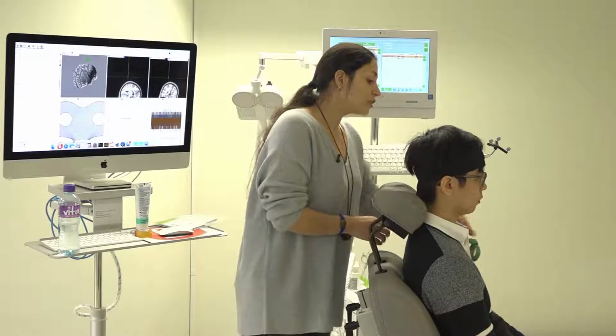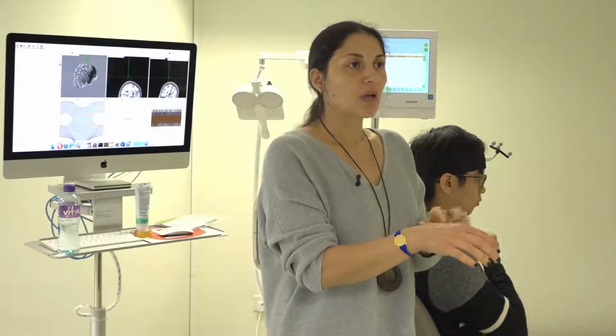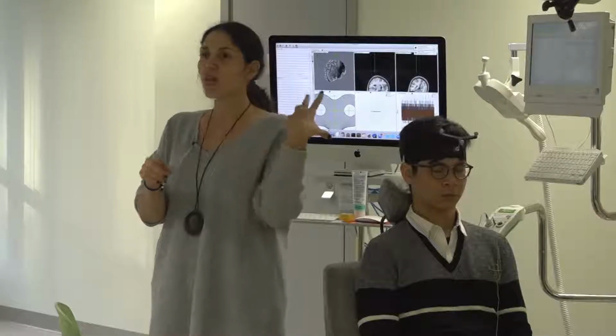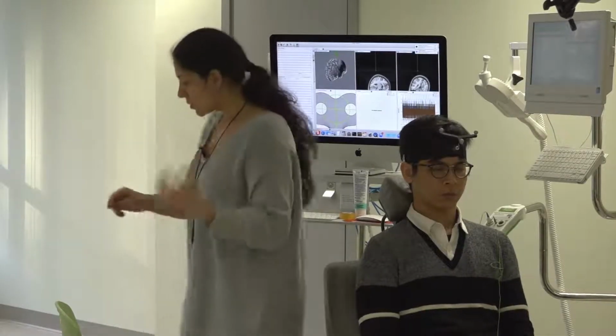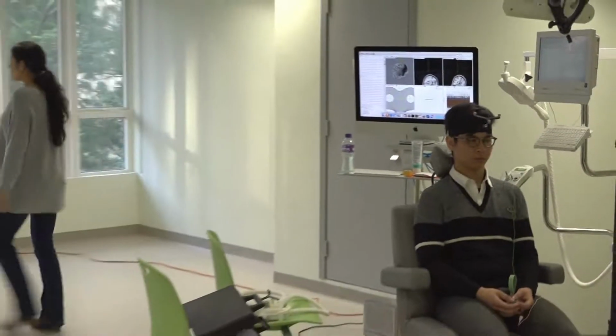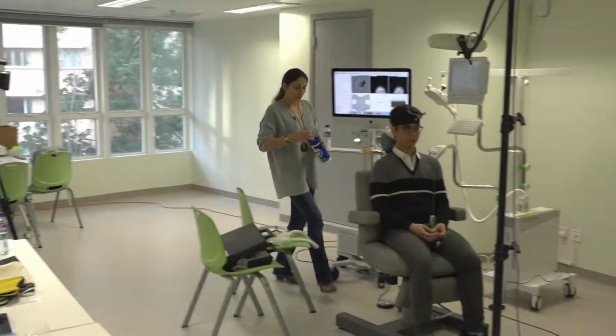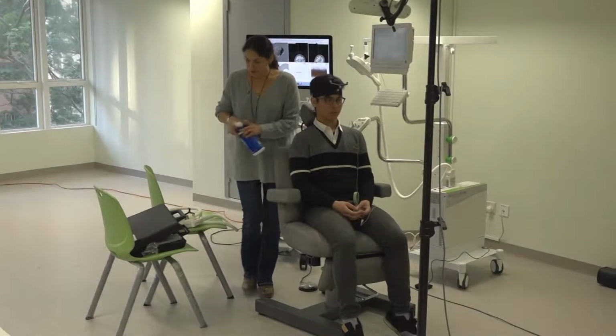Okay, normally what I do is I prepare the hand. I clean the hand, because just like for electroencephalography, you clean the area, right? And here is no exception. What I do is use alcohol, and then this gel, and I clean the area so I can have better contact of the electrodes with the skin, and then I can have a nicer image. We don't really have alcohol, but we have something like wet wipes. I'm going to use them to clean Joseph's hand.